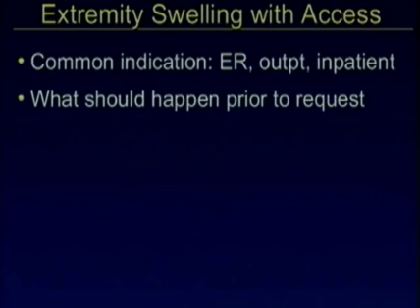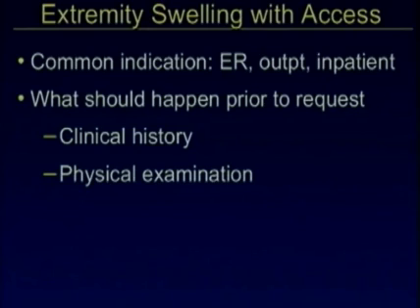What should happen prior to the request for an ultrasound, and this is optimal but doesn't always happen? First of all, the clinician should do a good clinical physical examination and get a good clinical history. For example, do they have a graft? Do they have a fistula? When was it placed? They should also listen to the graft as well as put their hands on the graft, because often if there is a stenosis present, you can feel the bruit. And then they may or may not have labs drawn to assess for dialysis adequacy, because this may be a problem that is brewing for some time.